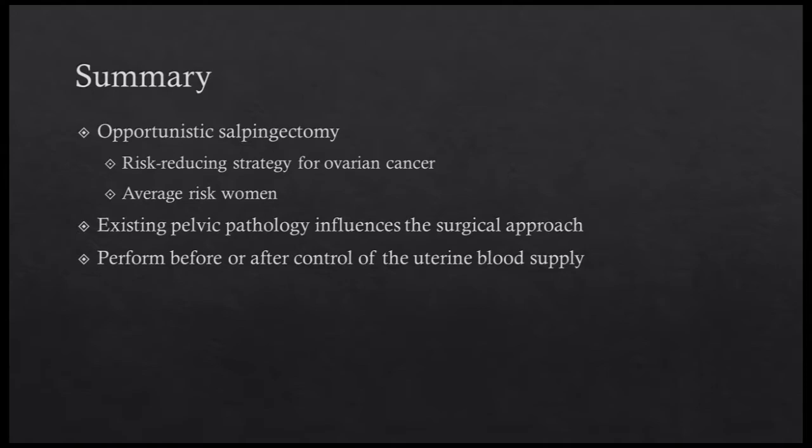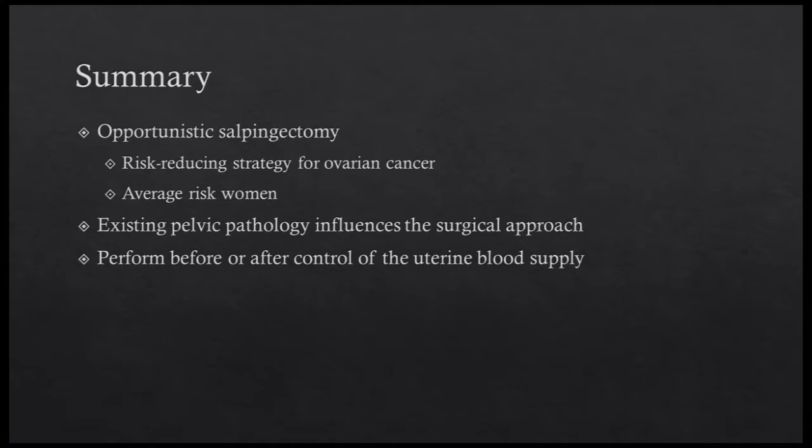Opportunistic salpingectomy is a risk-reducing strategy for women at average risk of ovarian cancer. It can be performed at the time of hysterectomy or other pelvic surgery. The existing pelvic pathology dictates when to perform the salpingectomy as well as how to approach the procedure itself. Keys to optimizing the dissection include maximizing exposure to the fallopian tube, presenting the tissue in parallel to the vessel sealing device, and providing gentle, constant traction and counter-traction. The specimen should be removed immediately to prevent its loss in the pelvis.